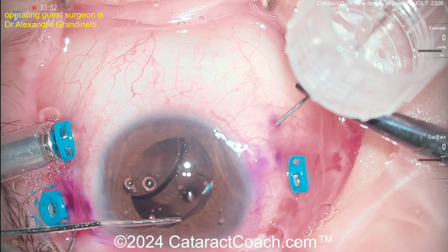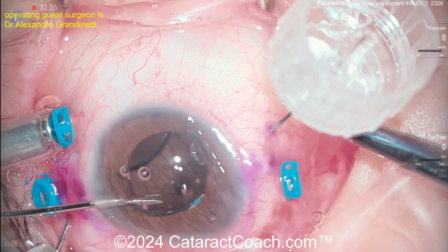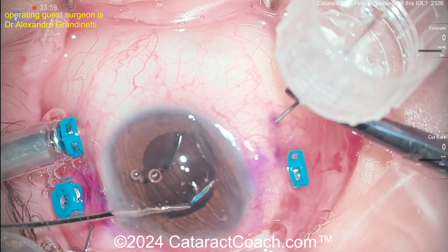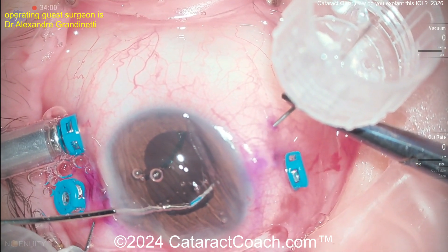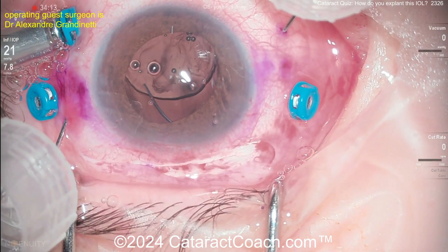This patient has had a full vitrectomy, so that's okay. That's why when you see the lens sitting in the mid-vitreous, it doesn't matter — the full vitrectomy has already been done. Now externalizing both haptics to perform the Yamani technique, taking all these factors into consideration.